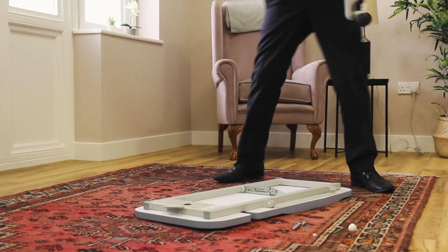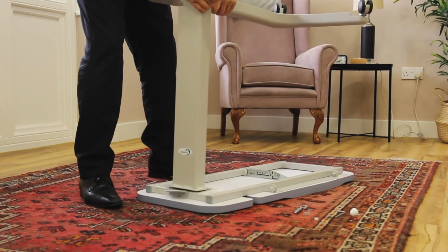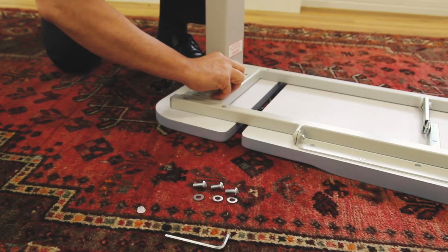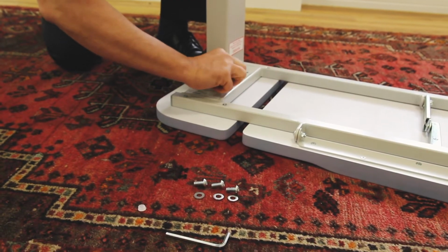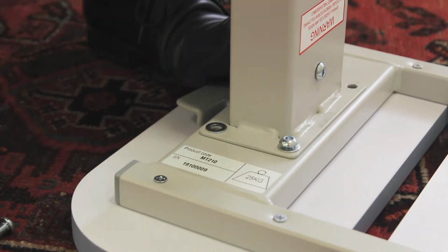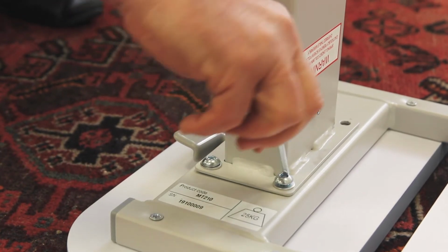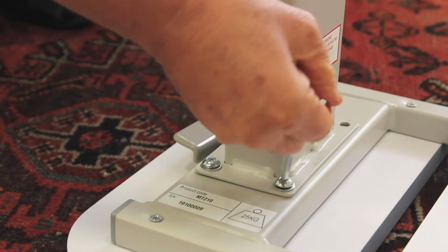Now attach the post with caster wheels to the table top. With the underside of the table facing up on a flat surface, line up the holes on the end of the post with the adjacent holes on the table. Connect these 2 components using the small screws. Make sure the washers are in place and remember to fully tighten with the Allen key.